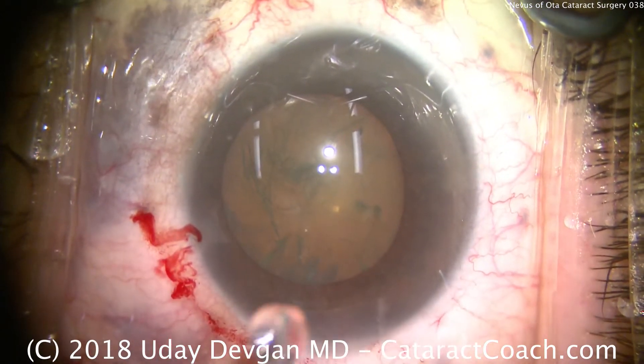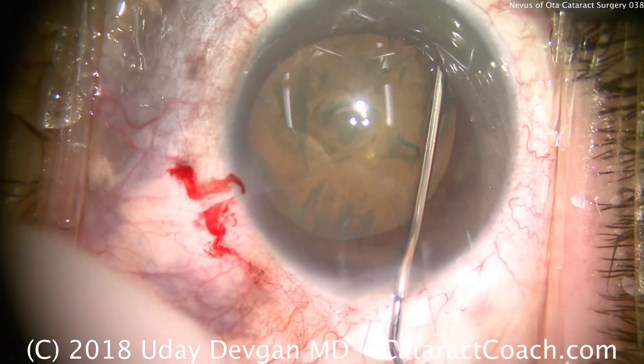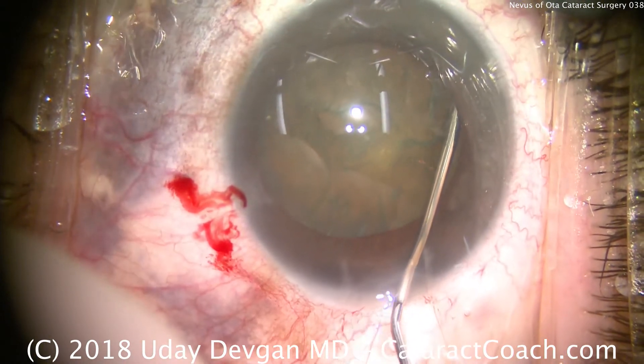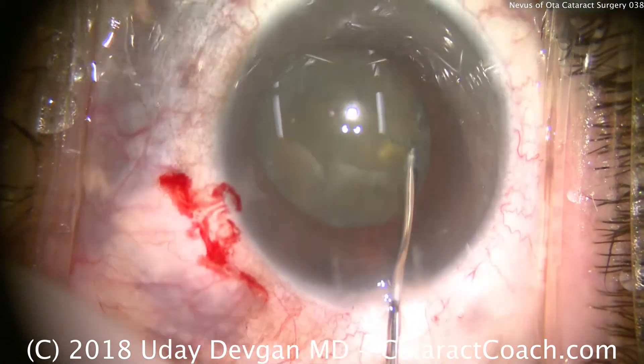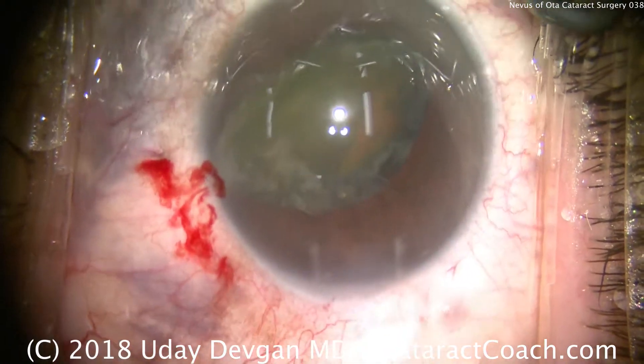The irregular pupil dilation at the beginning and the thinness of the capsule — I think I want to bring this nucleus out of the capsular bag. So gentle hydrodissection; we're going to bring the nucleus out of the capsular bag. If the nucleus is out of the bag, we'll place less stress on it.